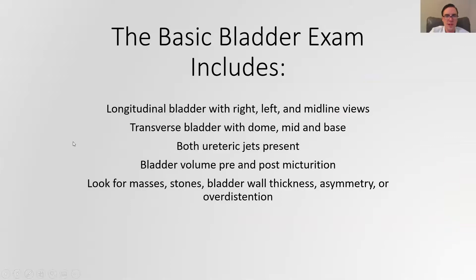For the bladder exam, think of it as drawing a tic-tac-toe on the bladder: you're getting three different views both up-and-down and horizontally — right, midline, and left. Then you want transverse views starting at the dome or top of the bladder, the middle, and the base. You'll also turn on the Doppler and look for ureteric jets to make sure that both kidneys are actually emptying urine into the bladder. Then you'll have the patient void to make sure that they can urinate, and you'll look at the bladder volume post-micturition — if there's still a lot of urine being retained after they try to urinate, that's indicative of urinary retention, which can cause kidney damage.